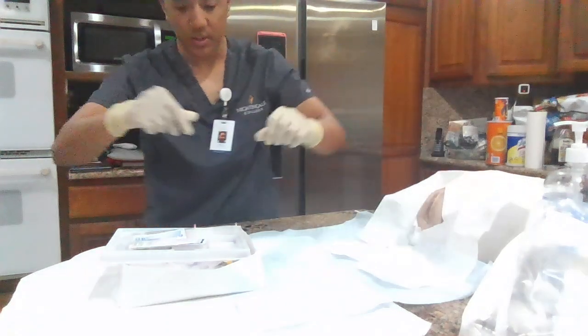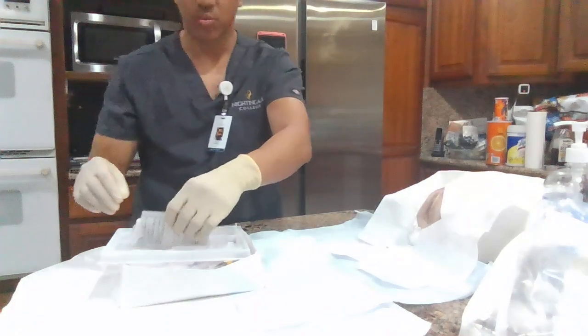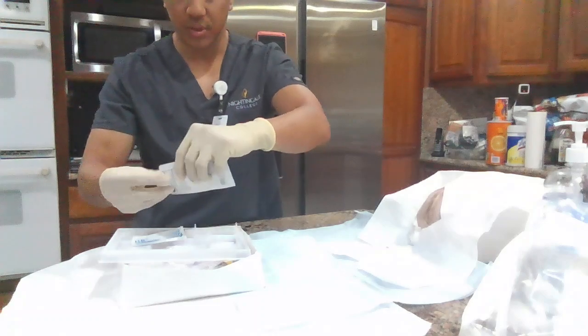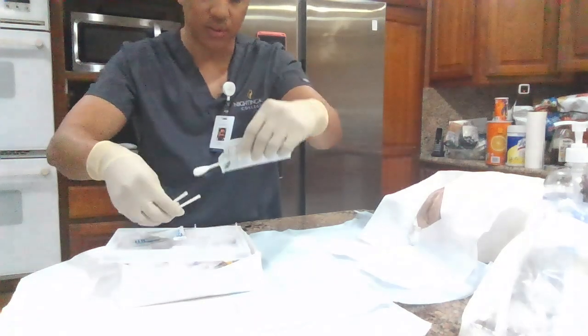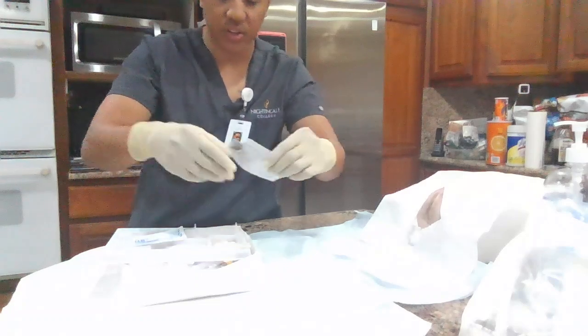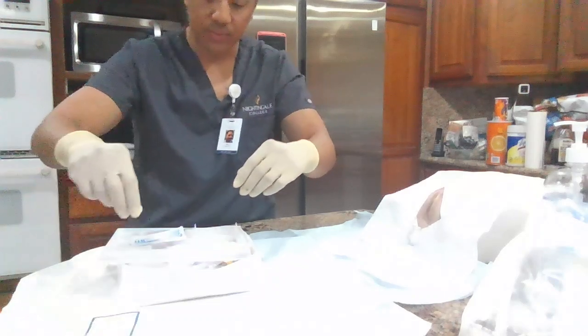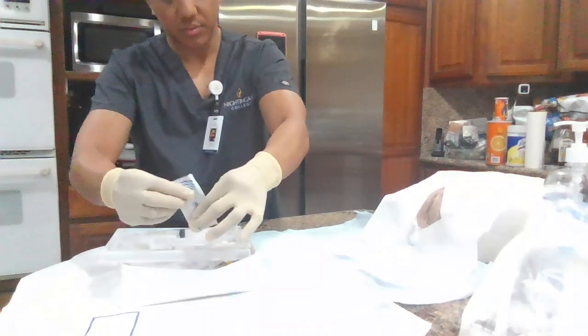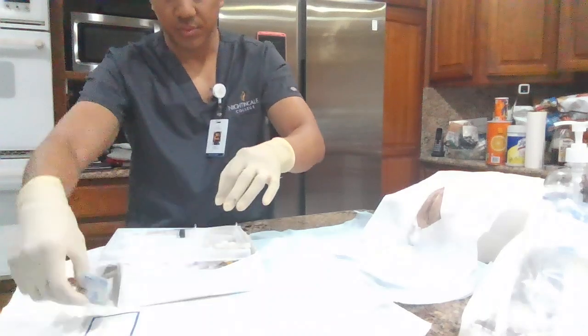Okay. I'm now going to take my alcohol swabs, open them, take my swabs out, and place them carefully where it's easily accessible for me to reach. I'm going to take my lube and open it. Okay.